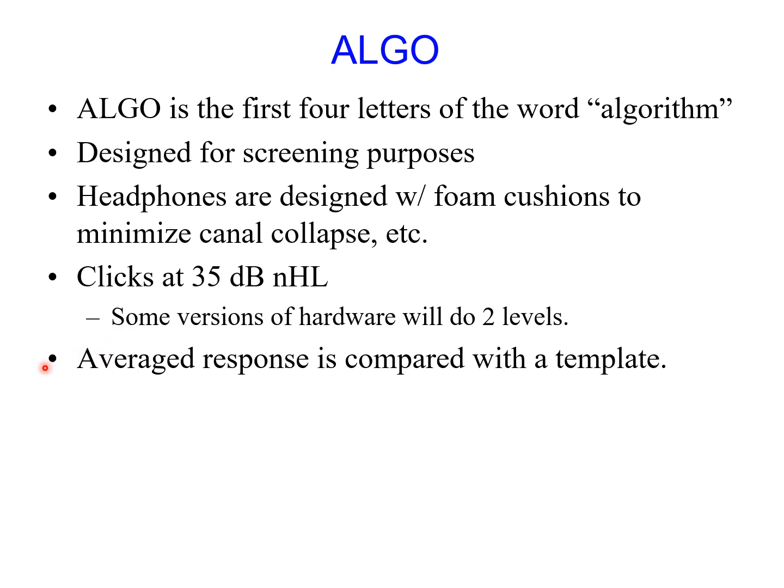The way it works is actually very easy and simple. We basically compare our averaged time waveform from a newborn to a template ABR waveform that is obtained from the average of a group of normal newborns. Essentially, we compare the ABR waveform recorded from a specific newborn or patient to a template, and a template is established by recruiting a group of normal people.